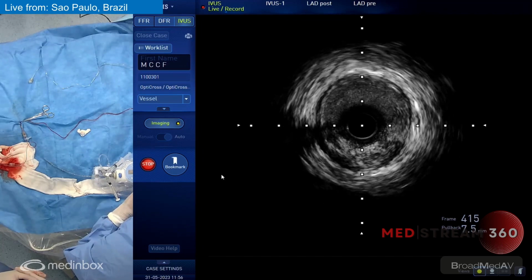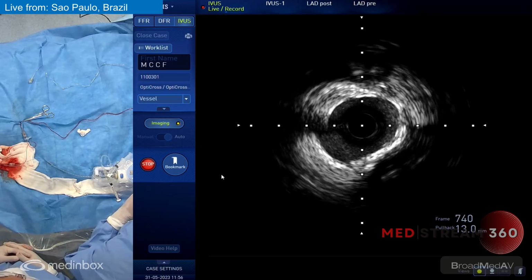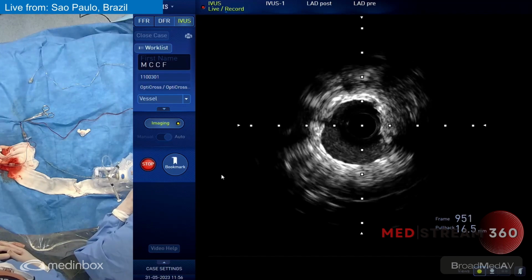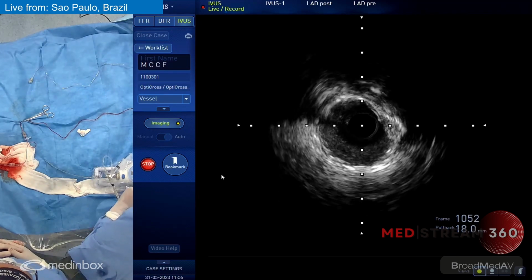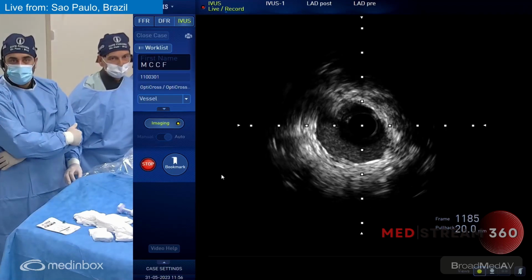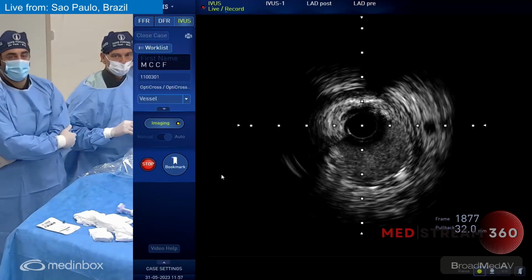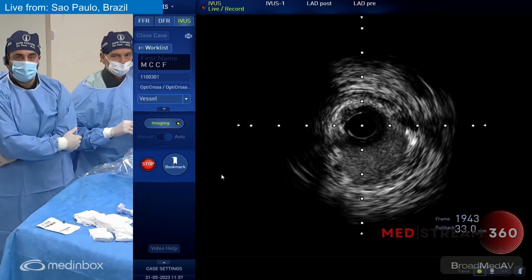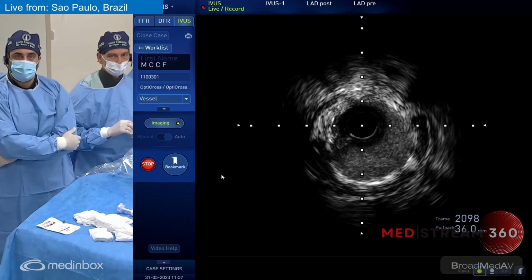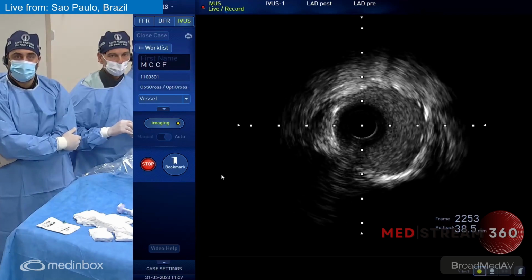That's a distal dissection here between 3 and 6. And here, that's the distal transition of the stent. See a well-opening stent here. We have a large plaque body behind the struts. That's a calcified portion, a little bit less expanded here. You see, Rodolfo, now it's a vessel that's more than 3.0, right? Yeah. It's a much larger vessel. Come here to a larger portion of the vessel. Maybe here you could also post-dilate with a 3.5 balloon, because the vessel is really larger now, and that's the importance of using imaging guidance in this type of very complex lesions with CTO.